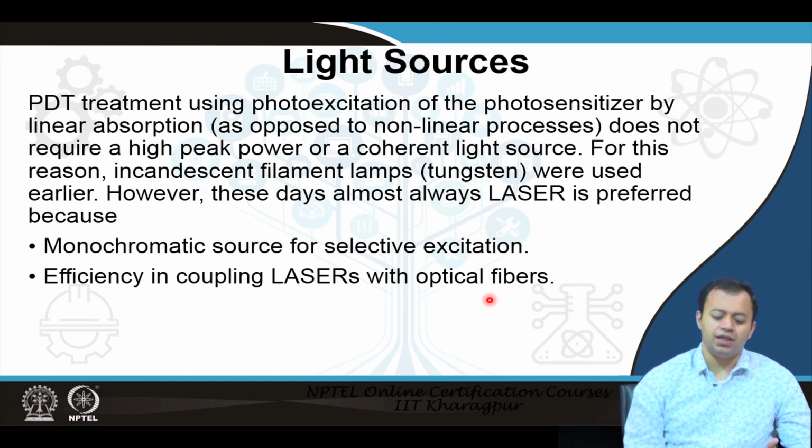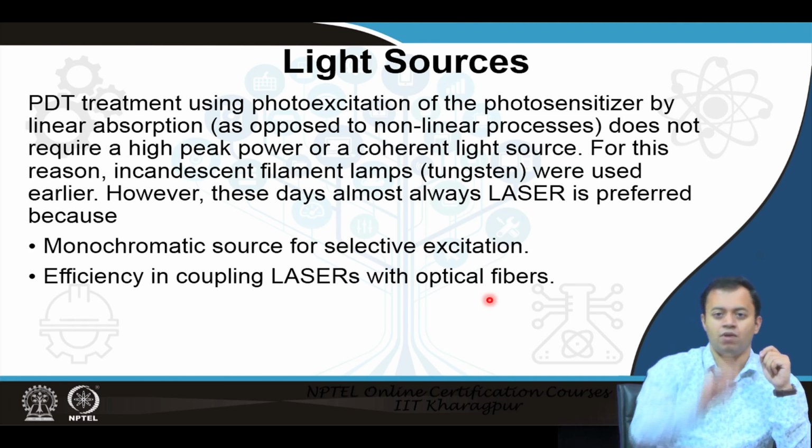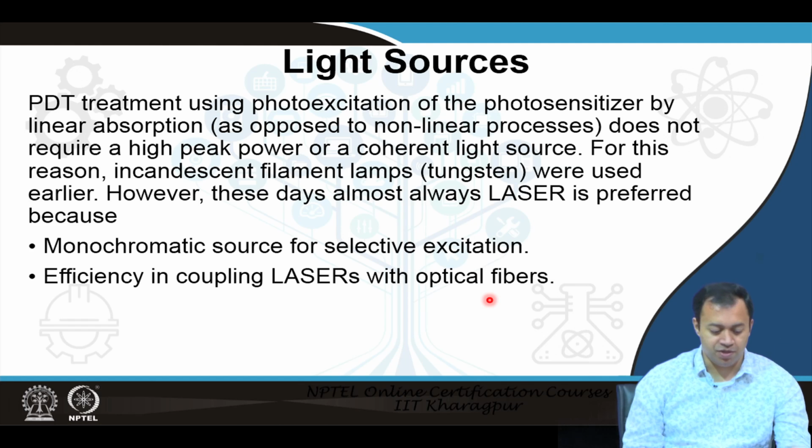One of the fibers carries the specific laser light that excites the photosensitizer drug, and the rest simply collect light and monitor the surrounding area, thereby monitoring the overall PDT process. Therefore, for all intents and purposes, instead of shining a torchlight in your mouth, we use lasers through optical fibers.